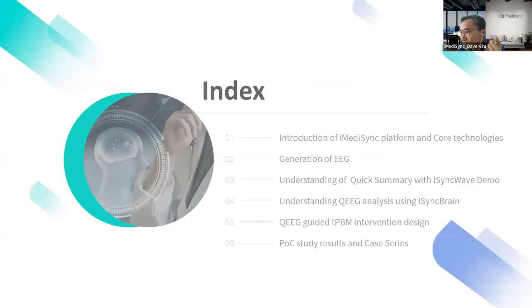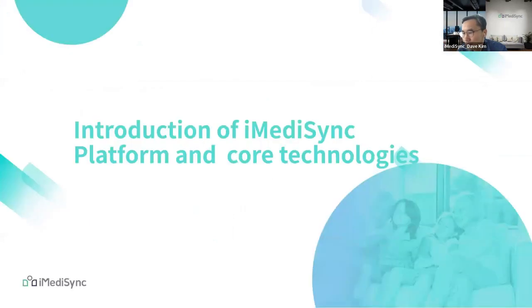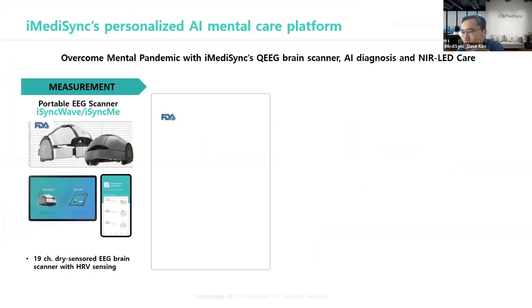This is today's topic: the platform and iMediSync core technology and generation mechanism, and what is the quick summary, and how we can understand QEEG analysis, and how we can integrate QEEG and PBM protocol intervention design. That's today's topic. And first, I'd like to introduce the iMediSync platform and the core technology.